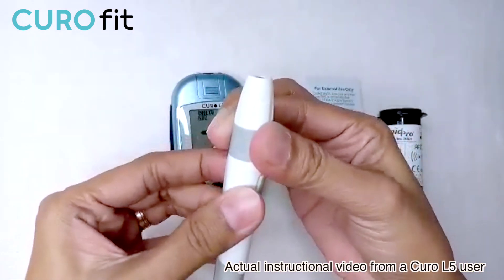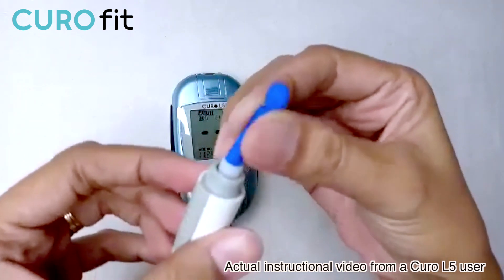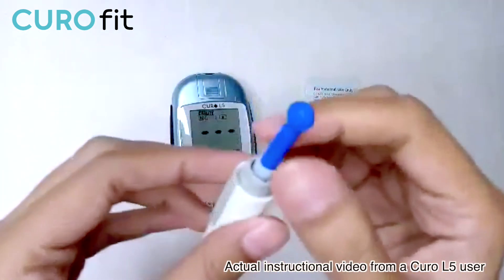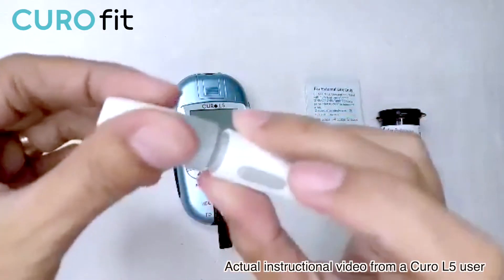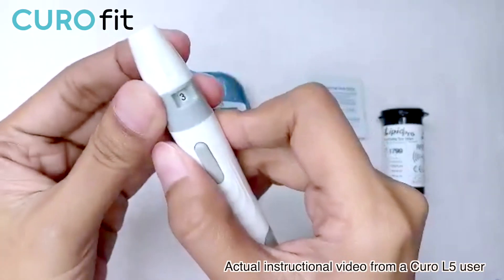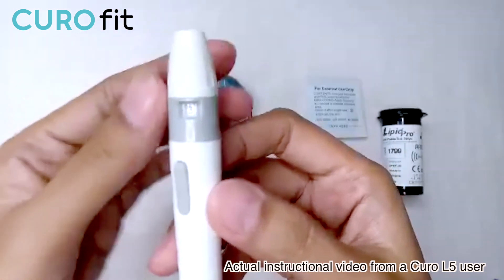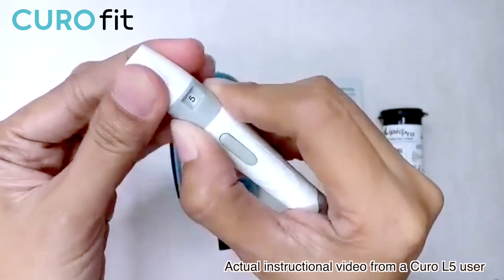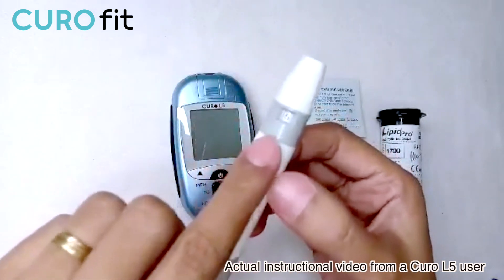To perform the test, first unscrew the lancing device. Push the lancet firmly until it hits the base, then load the lancet by pulling the bottom part of it, and remove the tip of the lancet. Apply the lid back — it's now ready to lance. The number showing here is the depth setting, adjustable from 1 to 5. Number 1 is the shallowest and number 5 is the deepest. Because the device requires a good sample of blood, I'm going to go with number 5.